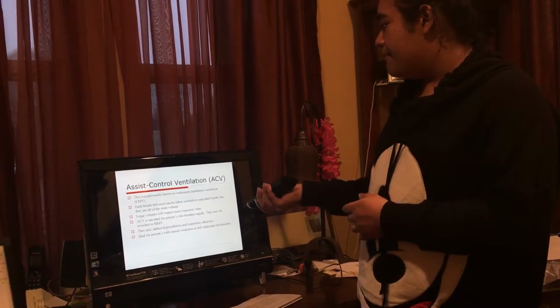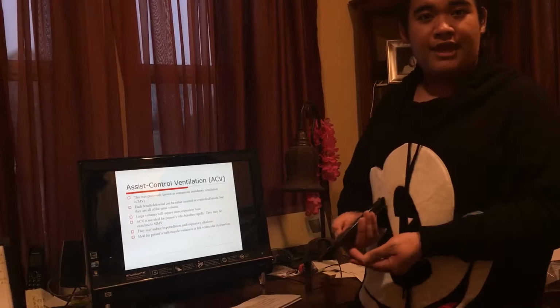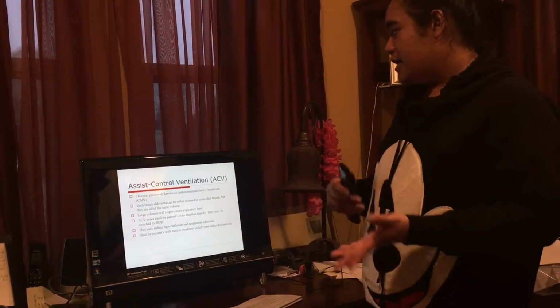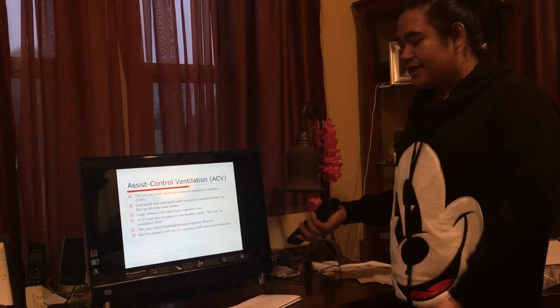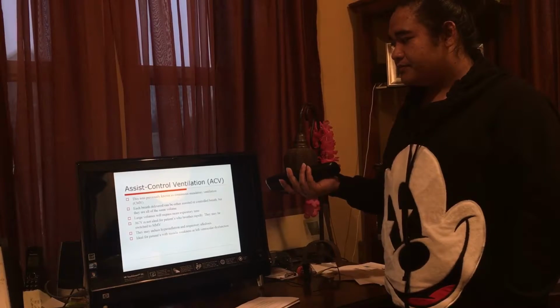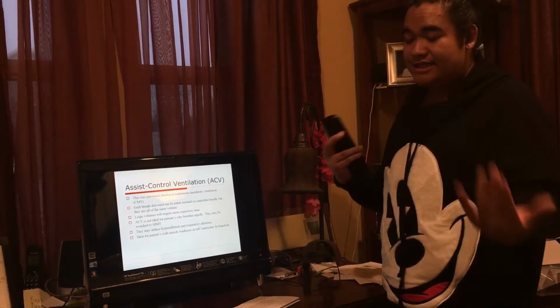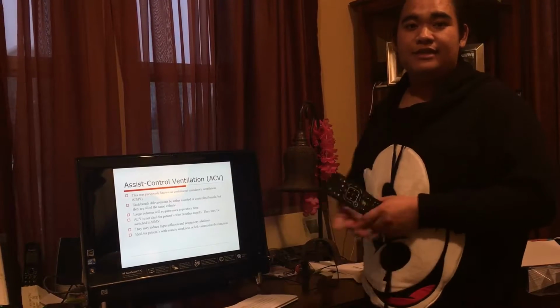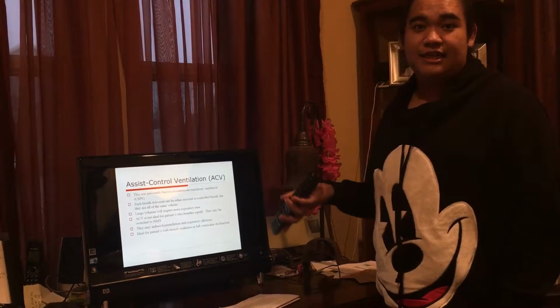This was previously known as CMV, or continuous mandatory ventilation. As we said earlier, each breath in here will be either assisted or controlled, because, as it states, it's assist control.